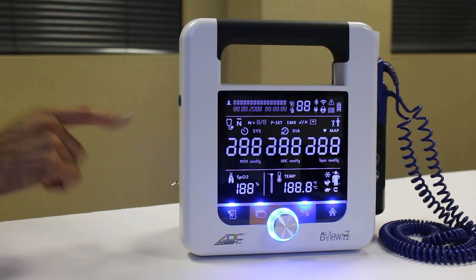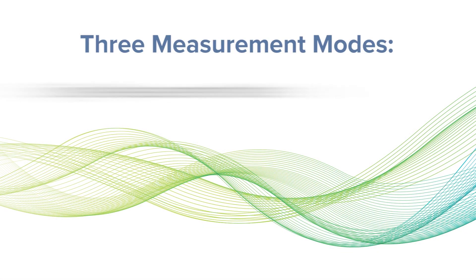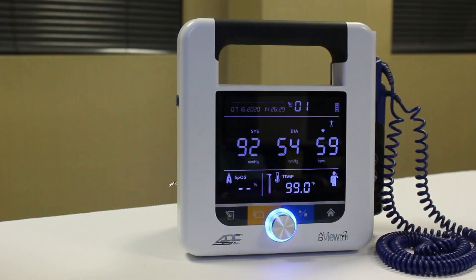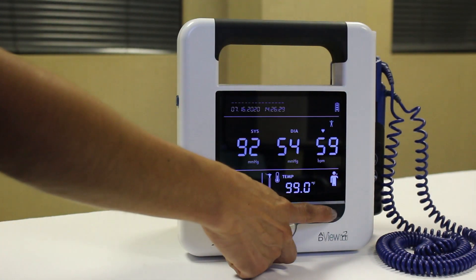If needed, turn the device on by pressing the power button on the left side. The ADVUE-2 offers three different blood pressure modes: single measurement mode, average mode, and manual mode. Your device will default to single measurement mode each time it's powered up. You can also revert to single measurement mode by pressing the home button.